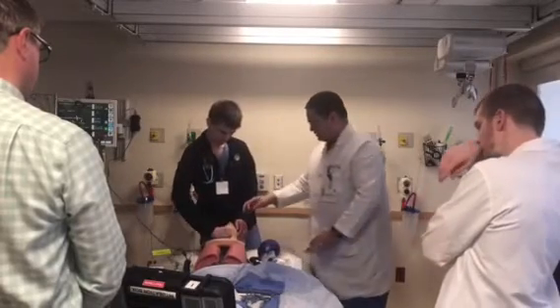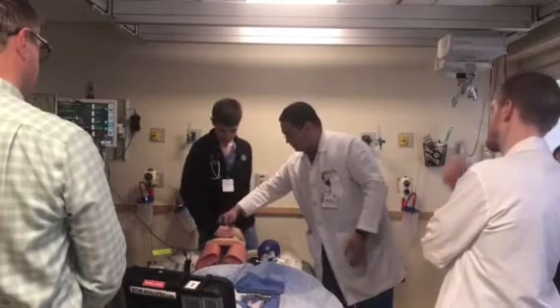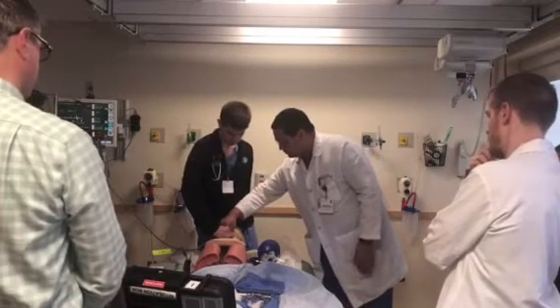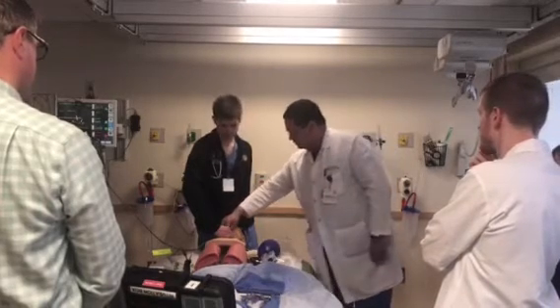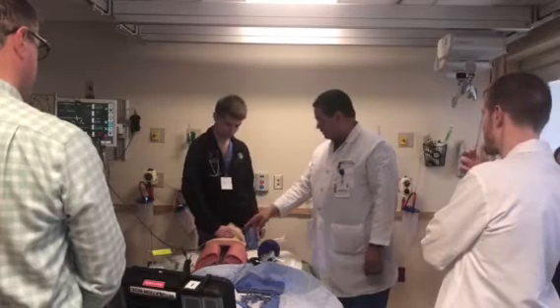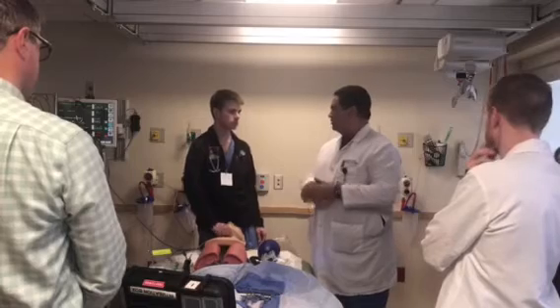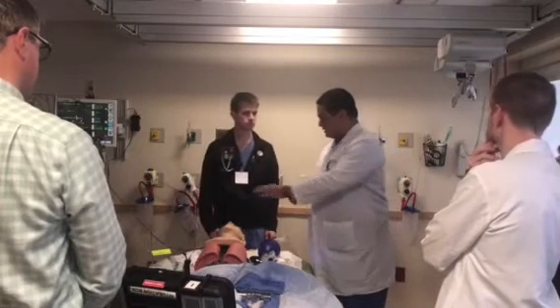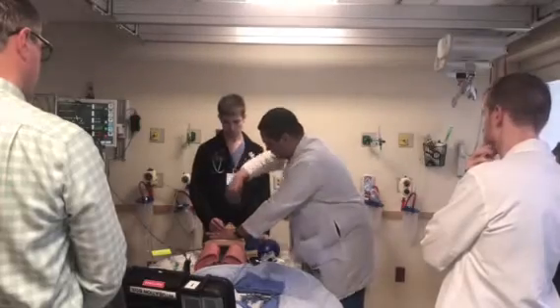You stretch it as much as you can, and the patient now, numb or unconscious, and between your fingers you just do half of the blade, basically, and just go between your fingers like this. By doing that, if you're stretching like this and you do half the blade, you will already be cutting the cricothyroid membrane. And the next step, without letting go of this, if you let go, a problem. The next step is to put the trach right away.